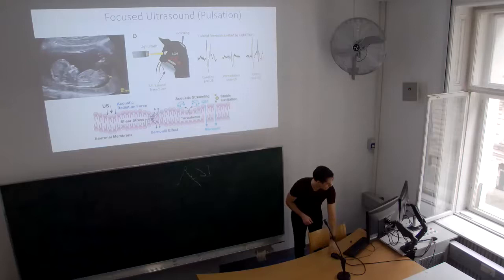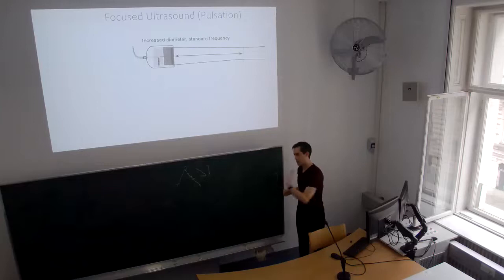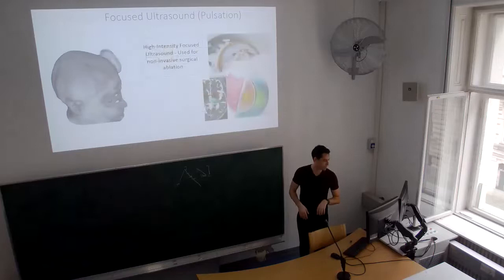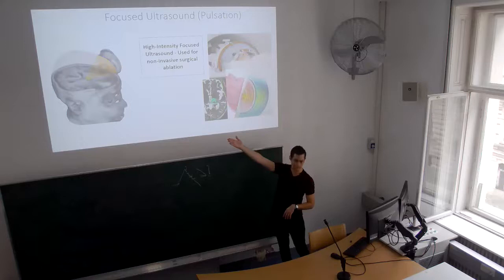Okay, so what do I mean by focused ultrasound, right? The ultrasound that comes out of an imaging device is just a flat wave that comes out and bounces back, but it's more useful for our purposes to have a focal point, okay? So we have maybe a curved element. The thing that generates the ultrasound is curved and it focuses all the energy onto a single point. So what we get is a point inside the head that's a much higher intensity than the intervening tissue, okay? So we can apply a relatively high energy to a point inside the head, like the thalamus here, right? Without impacting, at least to the same degree, the intervening cortical tissue between the transducer and the target, okay?